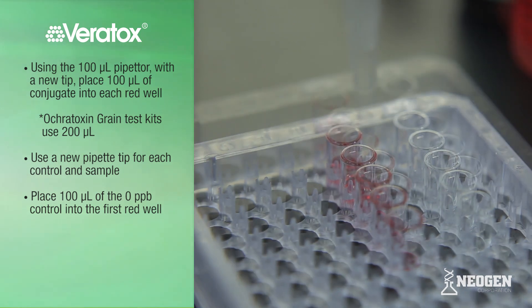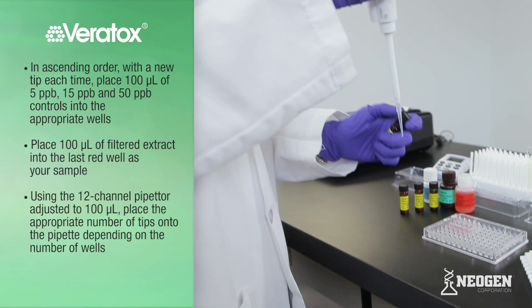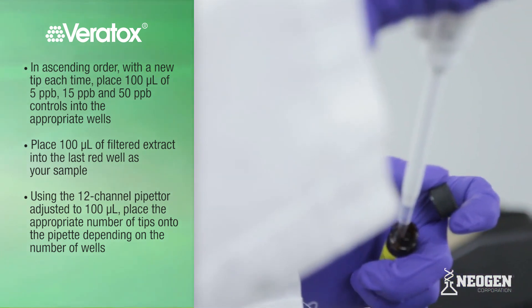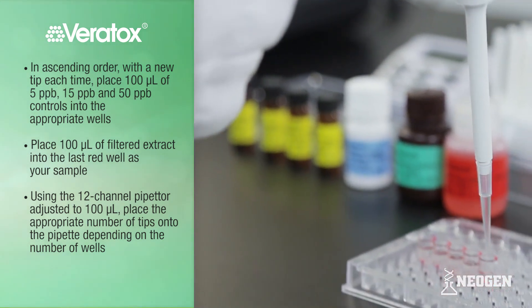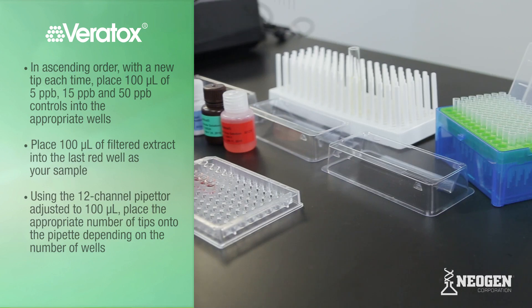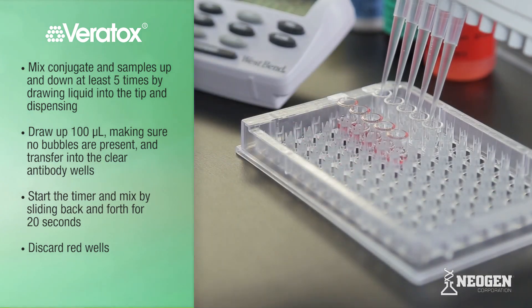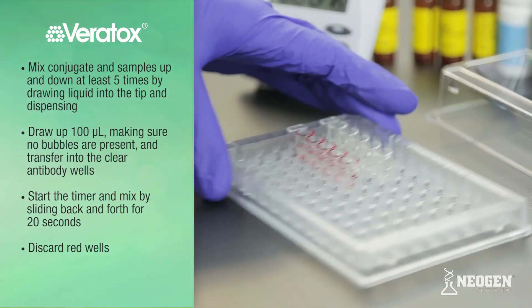Note that the Ocratoxin Grain Test Kit uses 200 microliters of conjugate for each red well. Using a new pipette tip, prime and pipette 100 microliters of the zero control into the first red well. In ascending order with a new tip each time, place 100 microliters of 5, 15, and 50 ppb controls into the appropriate wells. Place 100 microliters of filtered or diluted extract into the last red well as your sample. Using the 12-channel pipetter adjusted to 100 microliters, mix conjugate and samples up and down at least 5 times. Draw up 100 microliters, ensuring no bubbles are present, then transfer 100 microliters into the clear antibody wells. Start the timer for 2 minutes and mix by sliding back and forth for 20 seconds. Discard the red wells.